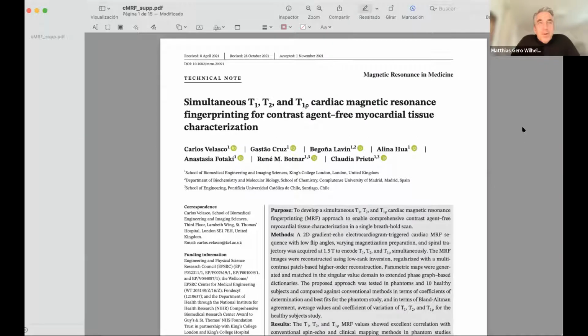So the overall time saved, doing a little math in my head now: if you take, let's say, 3 slices, and in 3 slices you get basically 9 different maps, that otherwise would have taken at least 3 times as much time.